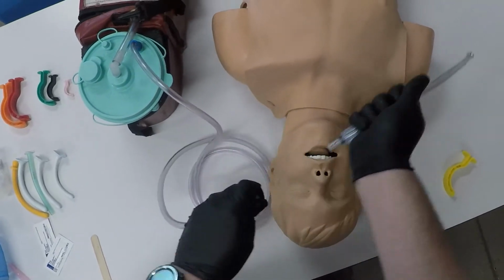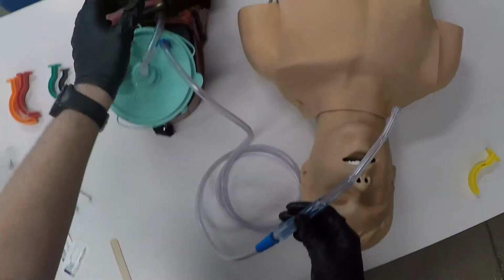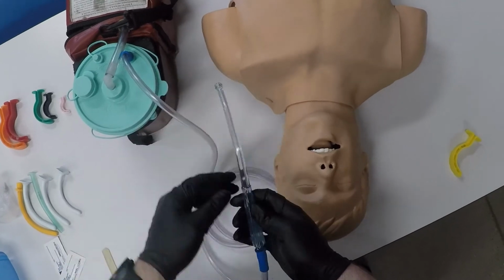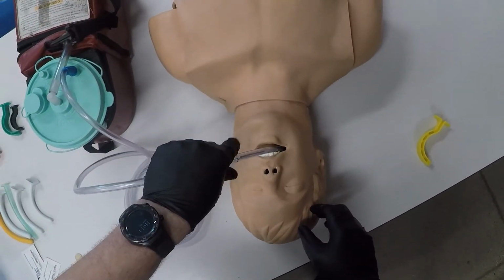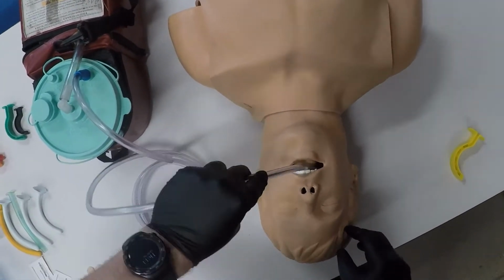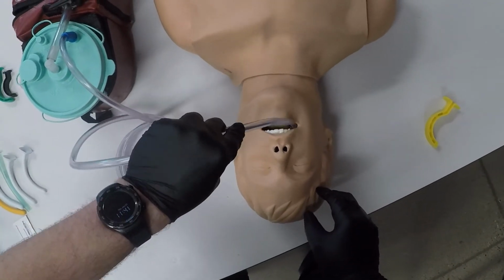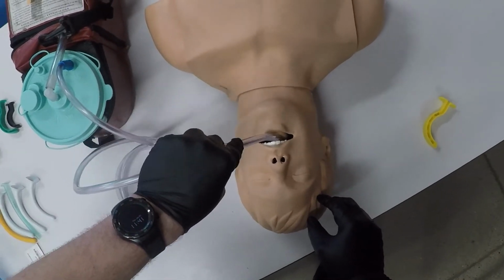I'm going to take my rigid Yankauer suction catheter, connect it to the tubing, turn on my suction device, and assure the presence of mechanical suction. Without suction engaged, I'm going to insert it into the oropharynx, engage suction, and begin to suction for no more than 15 seconds and no deeper than what I can see. I'm going to continue this until the patient's oropharynx and airway are clear.